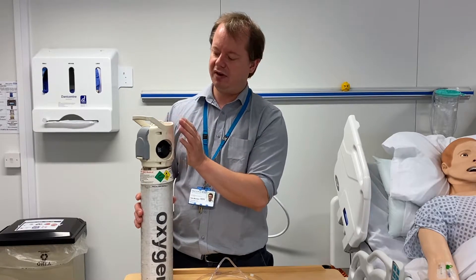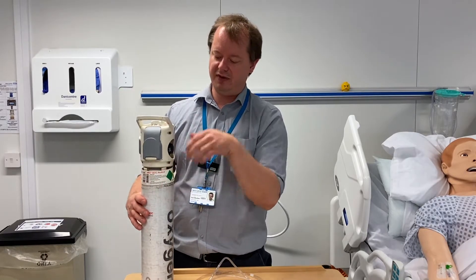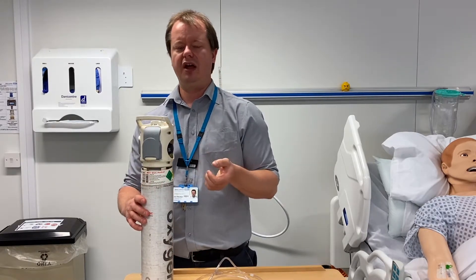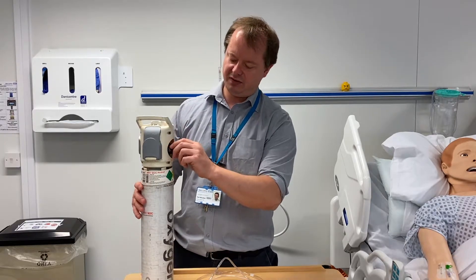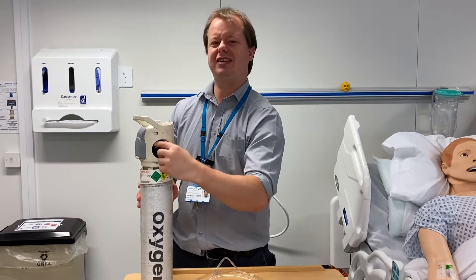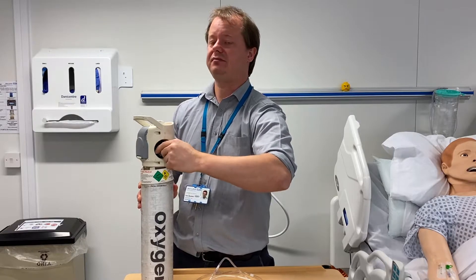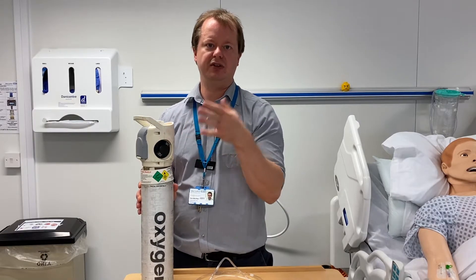When oxygen cylinders first arrive, this valve can actually be shut. So if you connect to your patient and turn it on, it won't actually work. When you first use it, you need to make sure it's open by turning the valve — you just turn it all the way until it stops, and then it'll be open. You can't turn it too far.